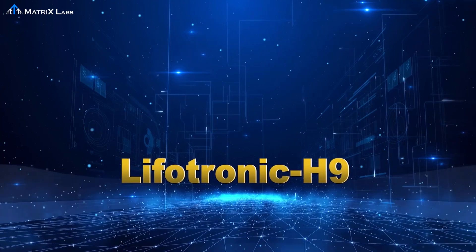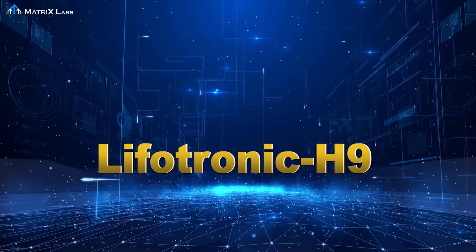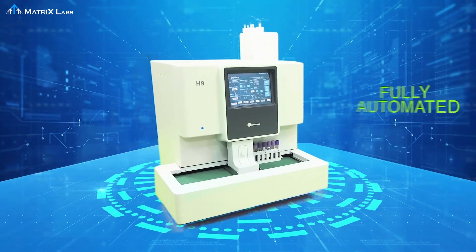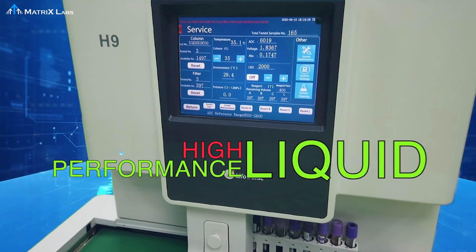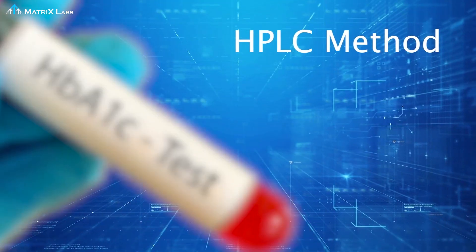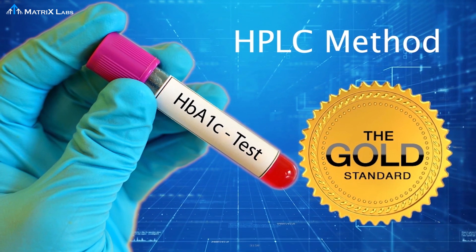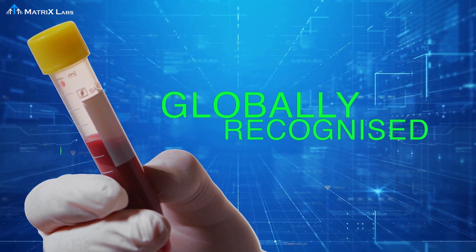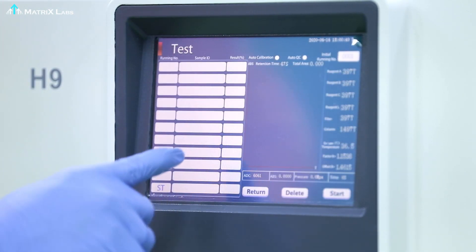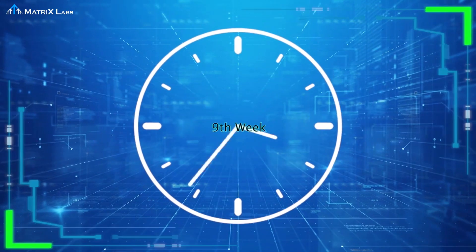H9 HbA1c Thalassemia and Variants Analyzer — H9 from Lifotronic is a fully automated hemoglobin analyzer which works on high-performance liquid chromatography (HPLC) method. The HPLC method is considered the gold standard for the estimation of HbA1c. HbA1c is widely recognized as the parameter to monitor diabetes, indicating the average plasma glucose concentration over 8 to 12 weeks.